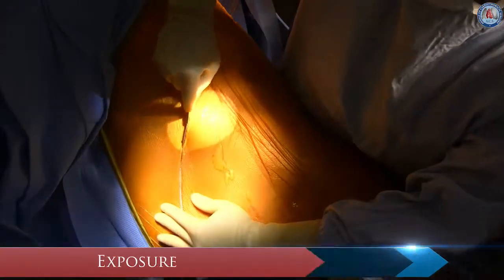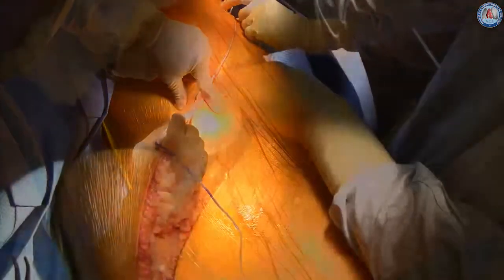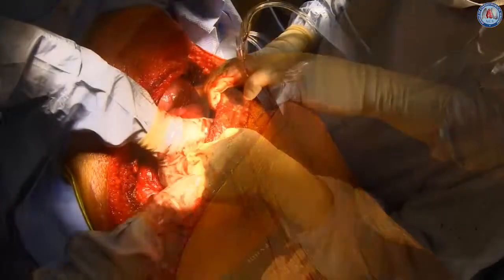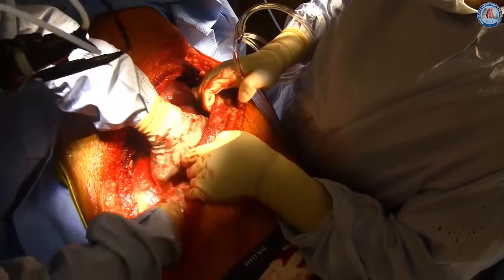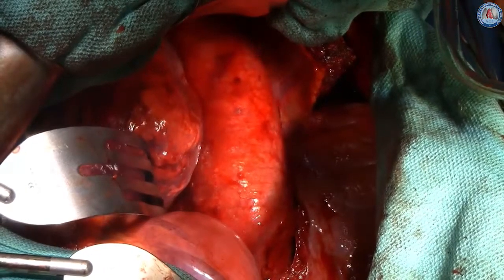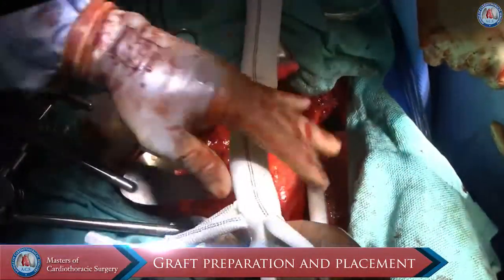A modified thoracoabdominal incision was made down to the 6th intercostal space. The latissimus dorsi and serratus are exposed. The diaphragm is preserved and the abdominal contents are rotated medially. The thoracoabdominal aneurysm is now exposed after the omni-retractor is placed, and the multi-branched graft is prepared with side branches oriented appropriately.